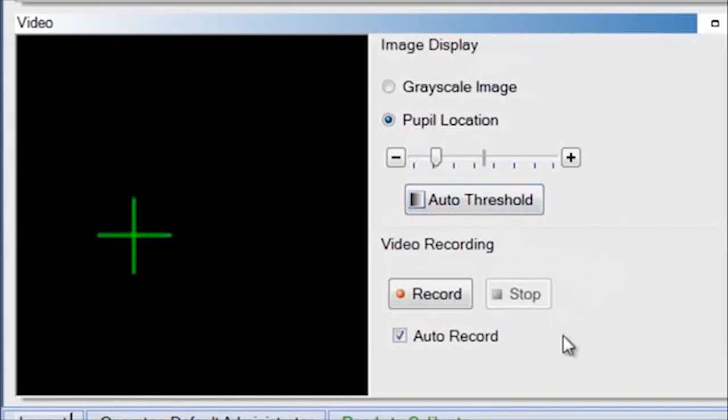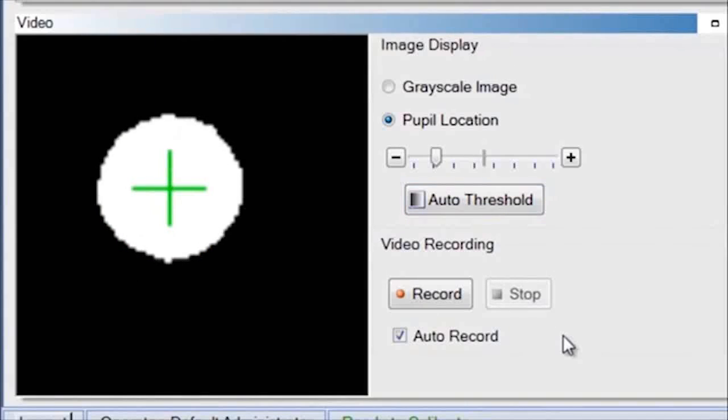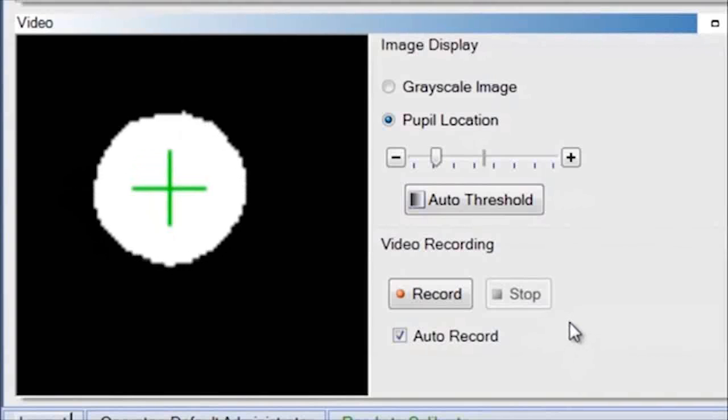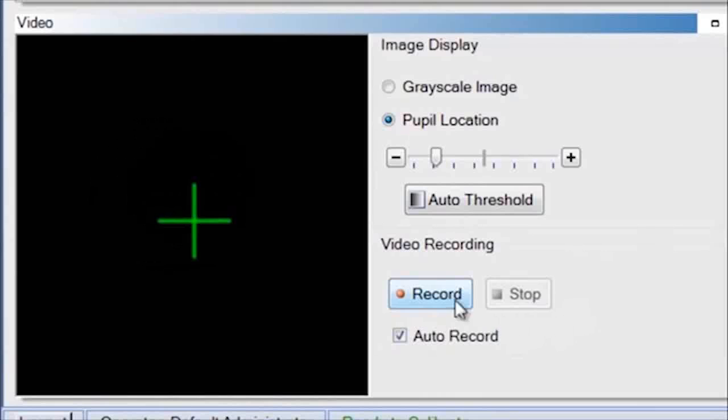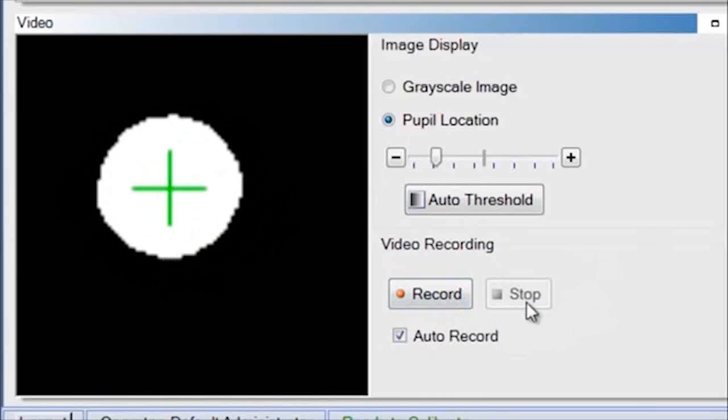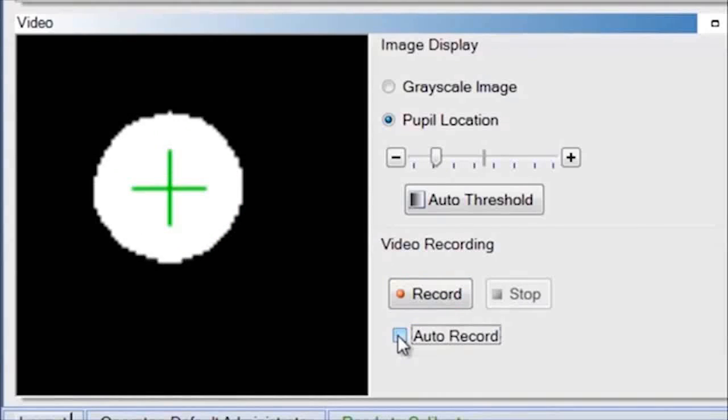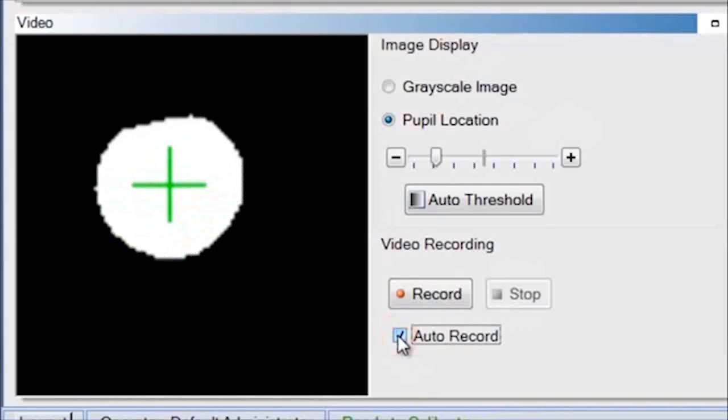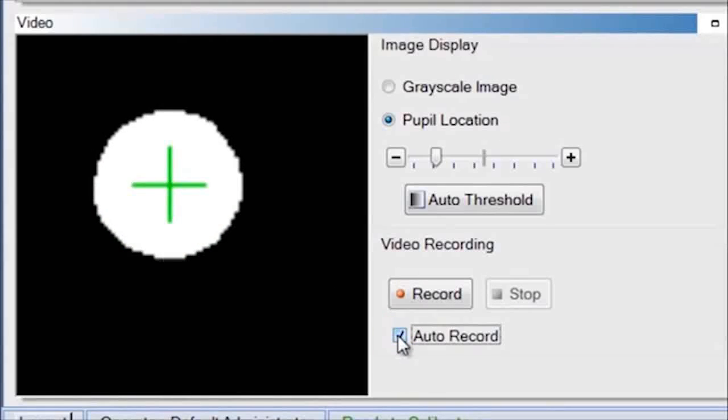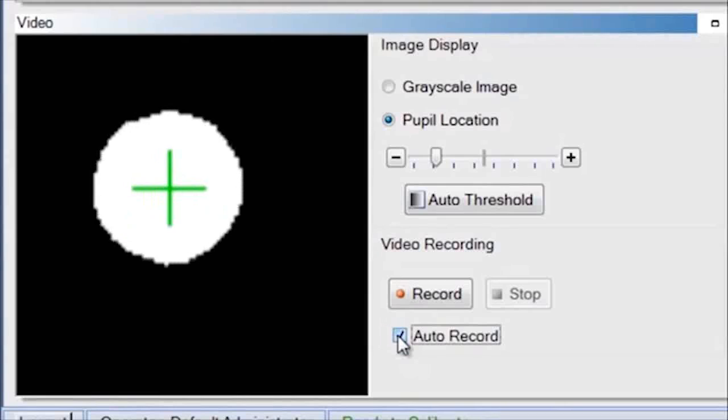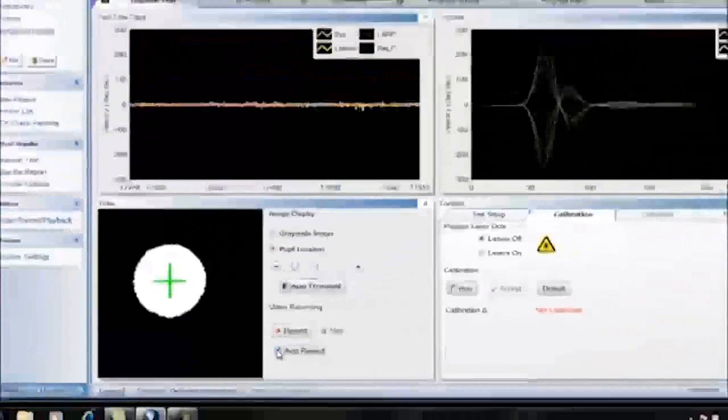If you want to video record the eye during the head impulse testing, you have two options. Use the control buttons to manually start and stop the video recording. To start the video recording at the same time as data collection starts, select the checkbox auto record, which will set the software to always simultaneously start the video recording when head impulse data collection starts.